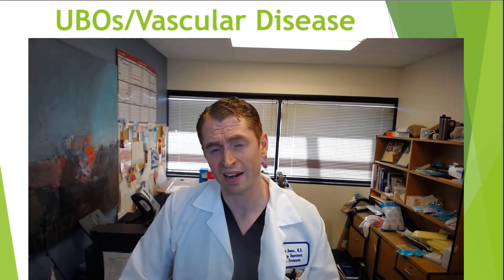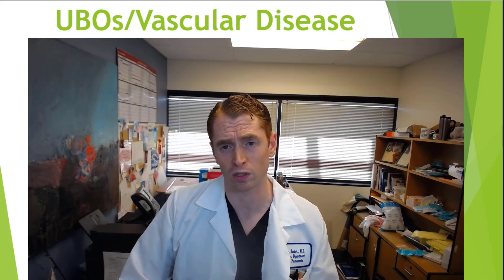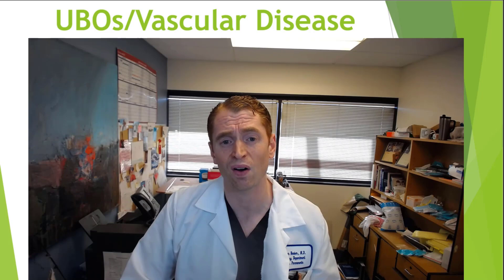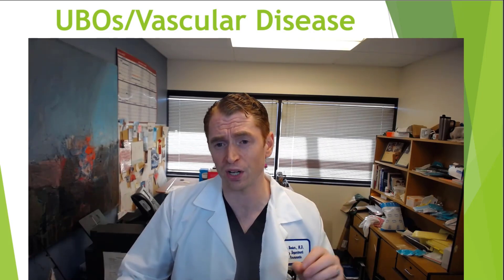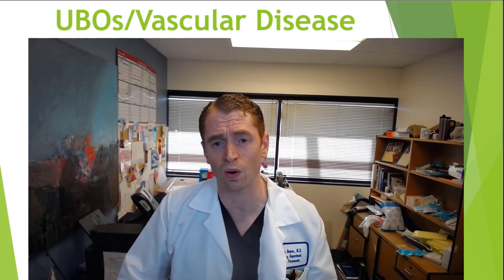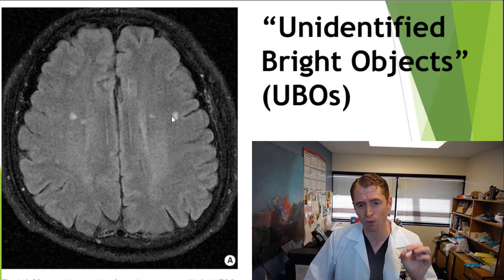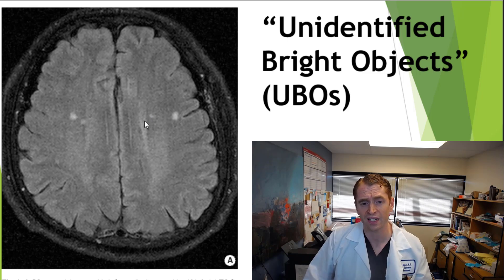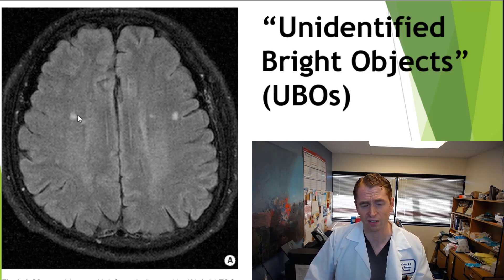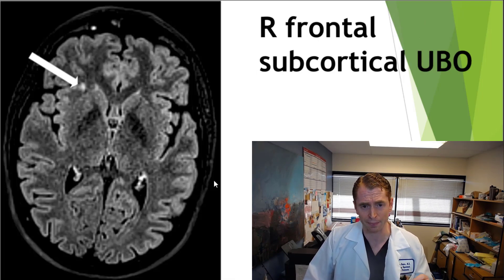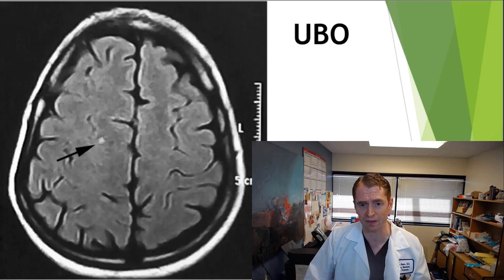Next we'll move to MRI findings that are not typical of multiple sclerosis — changes associated with UBOs, vascular disease, or leukoaraiosis. This axial slice shows small and poorly defined T2-bright lesions in the subcortical white matter. They're not periventricular, not touching the ventricles, relatively small, and a little bit indistinct. Here's another example — a right frontal subcortical UBO, very benign in appearance.